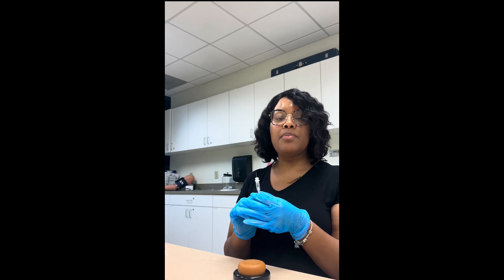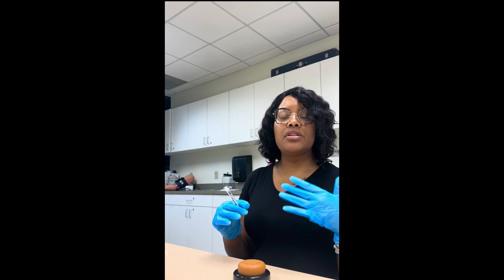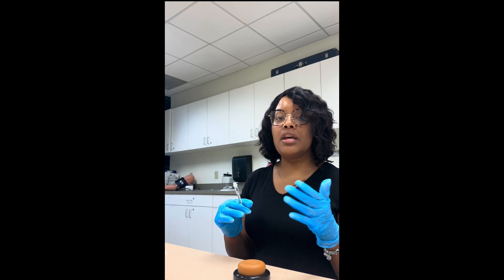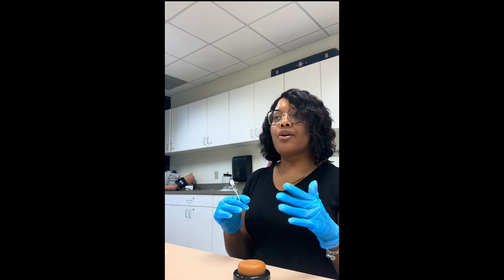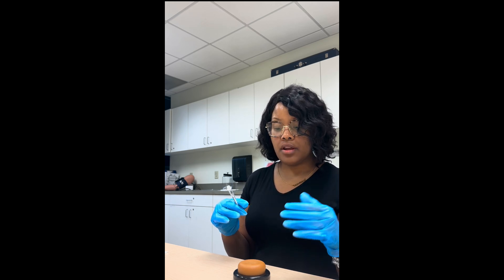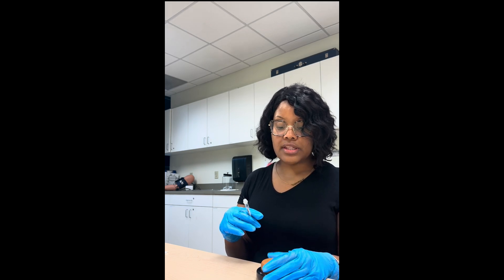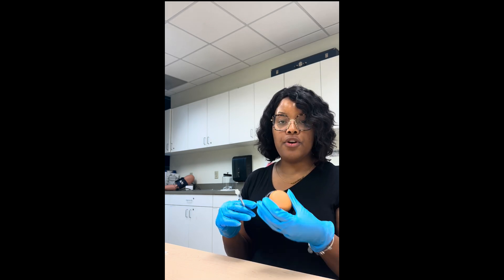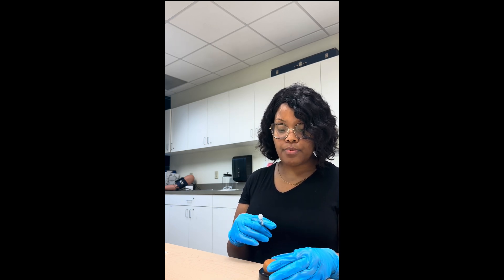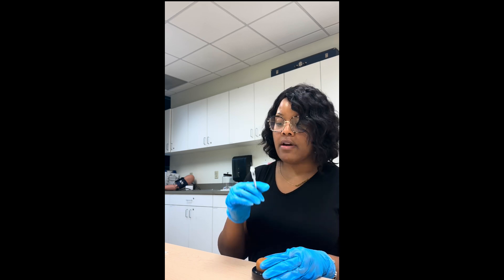I'm explaining to the patient what I'm going to do. Tell the patient they really shouldn't feel this, because it's just going to go under the layer of their skin — we're not going into the muscle or the tissue, we're literally going right up on the skin. You want to anchor your skin and get a firm grip. I like to pull my skin down just to give a little anchor on it.